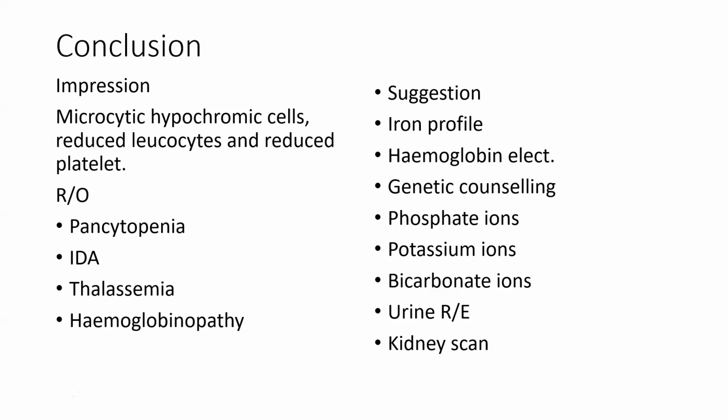In that case, you know that the neutrophil is supposed to be the highest, followed by the lymphocyte. Now that it is not above the upper limit anyways, but it is more than the neutrophil, then you can say, okay, maybe this is an onset of an infection, a viral infection or something. Then that becomes a starting point for your further investigations.